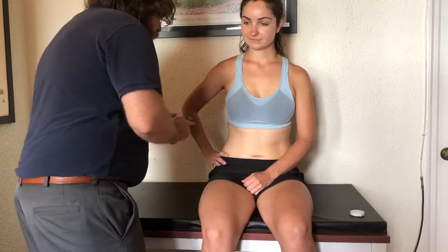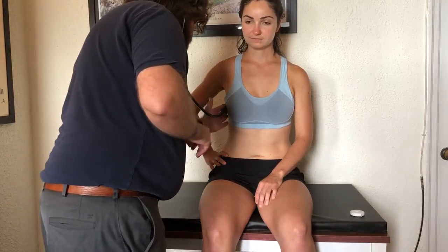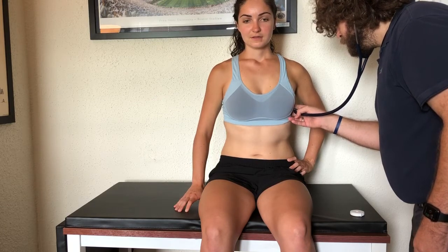I'll place my stethoscope in and give it a tap. I'm going to put your arm kind of on your hip here. So again we're going to come in the same plane, just a little bit more lateral. Okay, just breathe in here for a moment. Perfect. And breathe out. Breathe through your mouth please. And come to the other side for the lingula — same location. And her lungs sound perfectly clear.